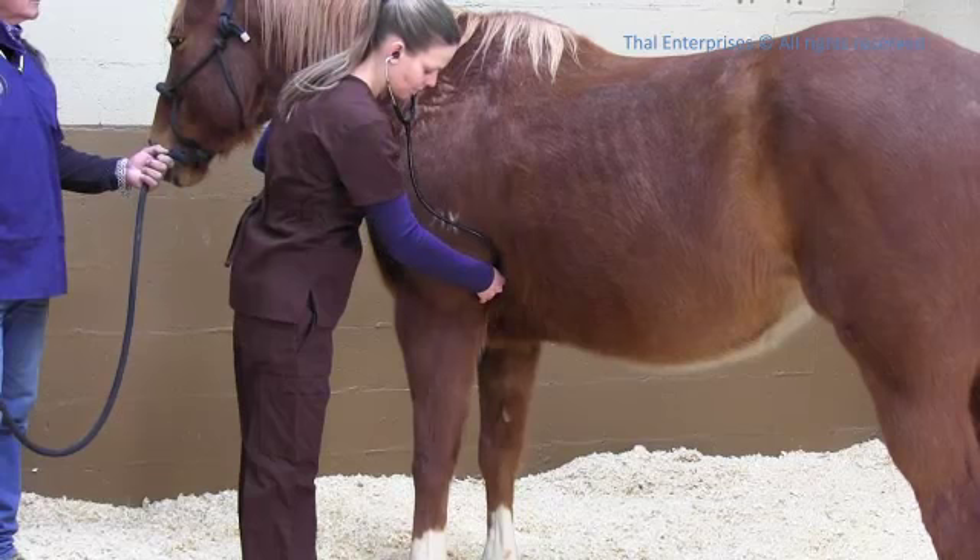Listen carefully as each lub-dub makes up one heartbeat. Count each beat in 15 seconds and multiply that number by 4 to get your horse's heart rate.